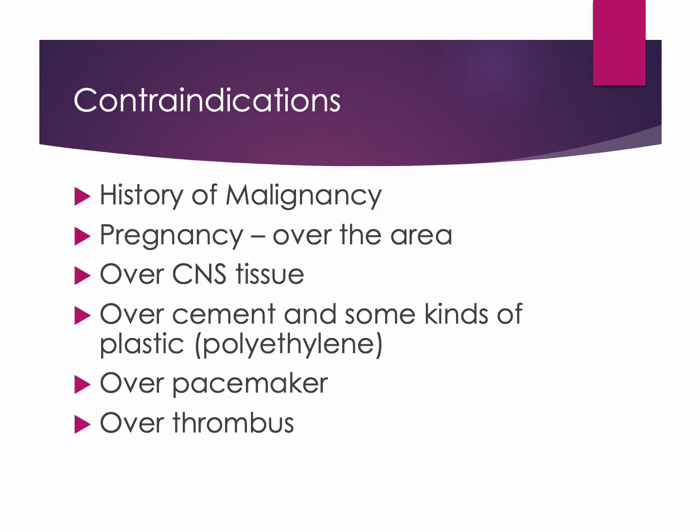Ultrasound should not be applied directly over a pacemaker. Although therapeutic ultrasound is not electrical stimulation, there are concerns that the mechanical energy and associated heating could potentially interfere with the device or surrounding tissues. Finally, ultrasound is contraindicated over an active thrombus or suspected deep vein thrombosis. Increasing local blood flow and mechanical energy could potentially contribute to clot dislodgement, which could lead to a serious complication such as pulmonary embolism.